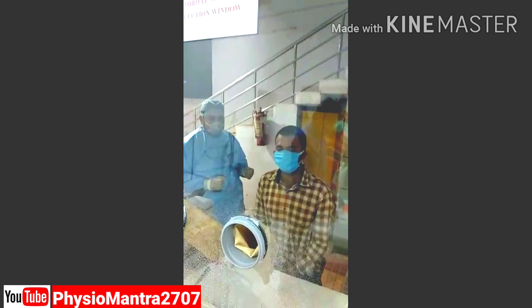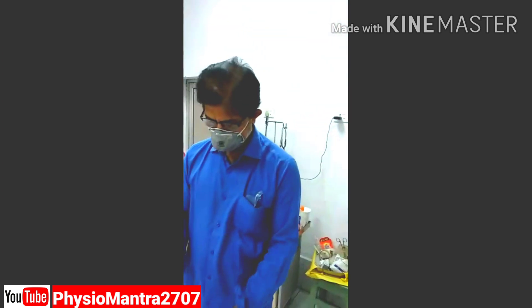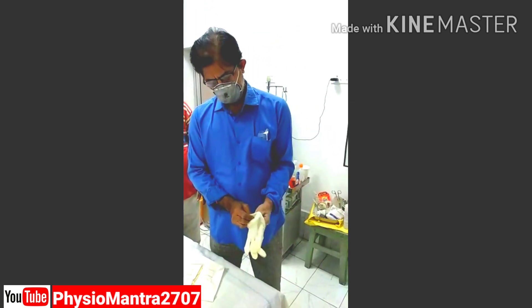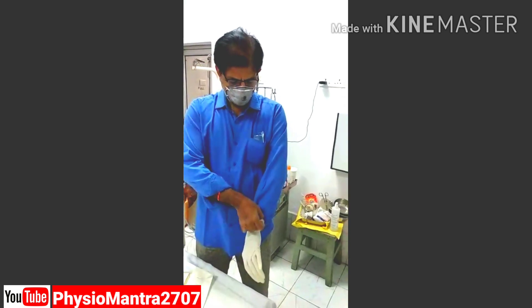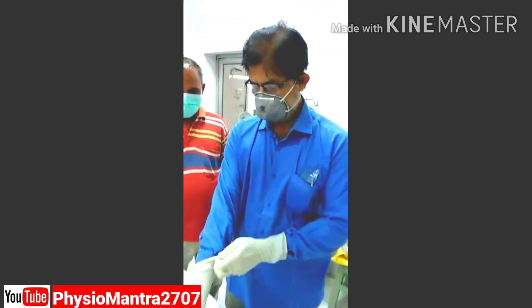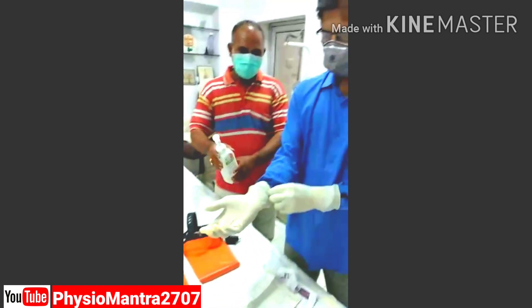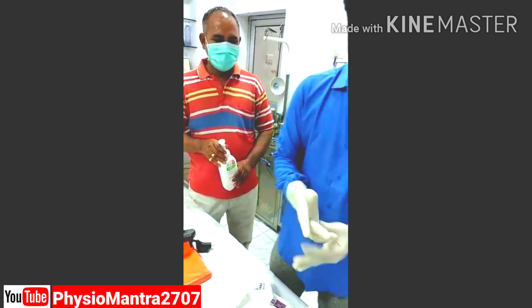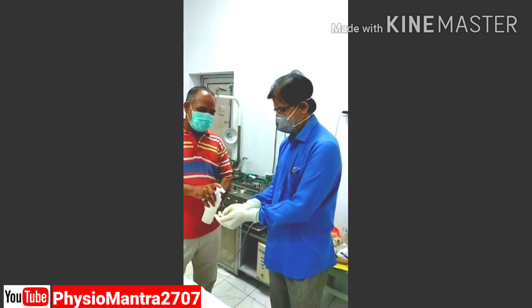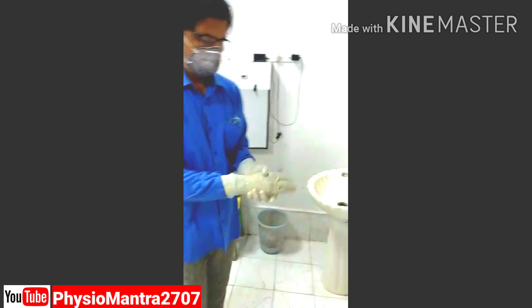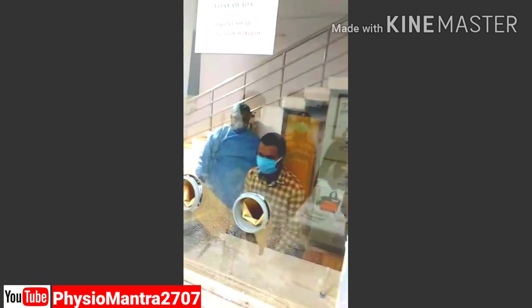This is the second case for which the sampling will be taken by Dr. Ravikant again. It is getting ready — it is almost ready. Sanitizing the hands with sanitizer. The patient is also ready.